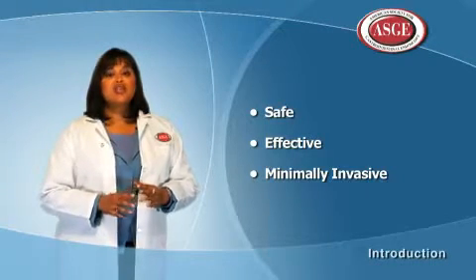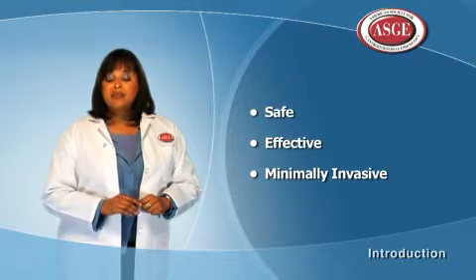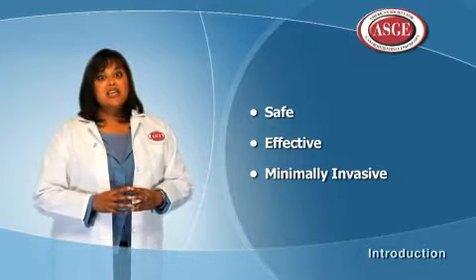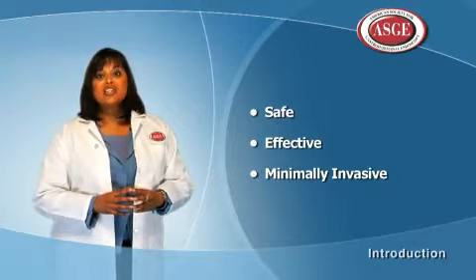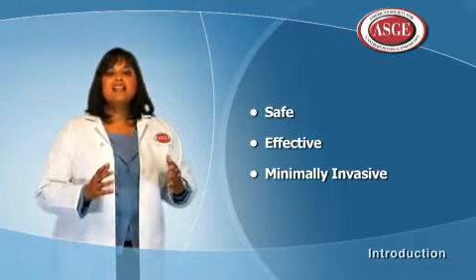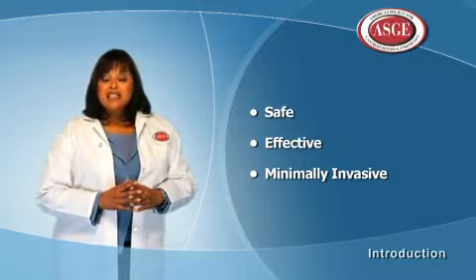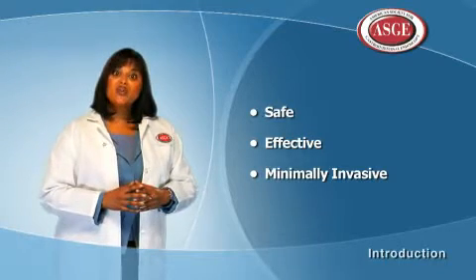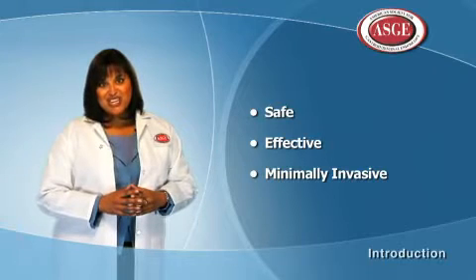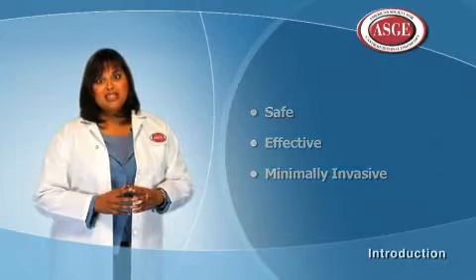Upper endoscopy has been used for decades. New innovations in technology have allowed upper endoscopy to do more than just look at the GI tract. Endoscopy can also be used to treat conditions that in the past would have required surgery. Millions of endoscopies are done in the U.S. each year. New endoscopic technologies allow it to be used not only for seeing inside the upper GI tract, but for use in diagnosing and treating conditions of the liver and pancreas with advanced equipment.